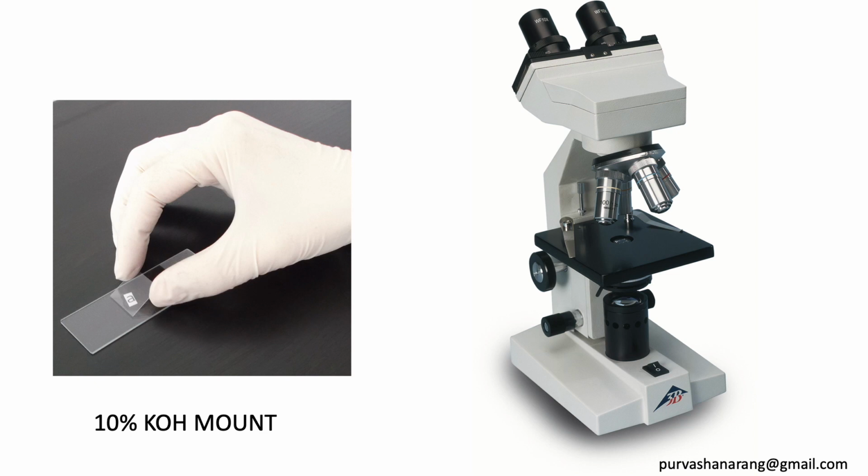Direct microscopy is the fastest way to know the presence of a fungus and can be performed in any bedside lab with a microscope. The sample is smeared on the center of a clean glass slide and a drop of 10% potassium hydroxide or KOH is added over it. A cover slip is placed carefully over it at an angle of 45 degrees and lowered slowly so as to avoid trapping of any air bubbles. Always remember to wear protective gear at all times while handling any of these specimens.